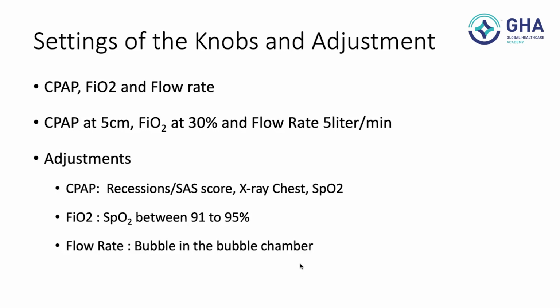Now, next thing is you need to see whether the retractions are coming down. So the moment you connect the baby to a CPAP, you will see that the grunt will disappear, nasal flaring will come down, and the retractions will start showing improvement. This is a sign showing that the pressure is going to the lungs and has started to recruit the alveoli. Alveoli are opening up and the FRC is improving.